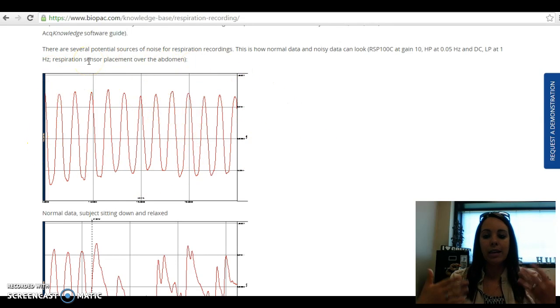if the subject was sitting down at rest, just normal breathing. So the patient or the test subject would be seated. There's a couple of ways that we could test this. One of the ways, we could put a mask on the face and measure respirations, or we could put a little sensor right around the chest to measure the rising and falling of breathing during respiration.